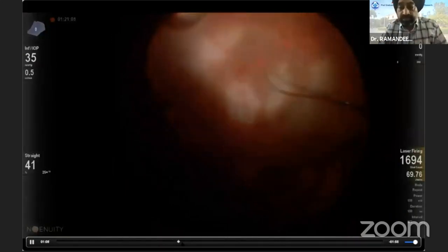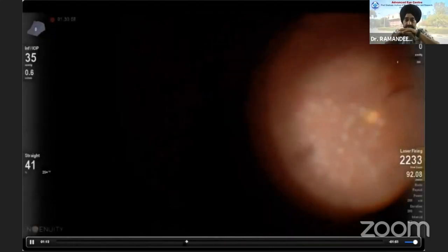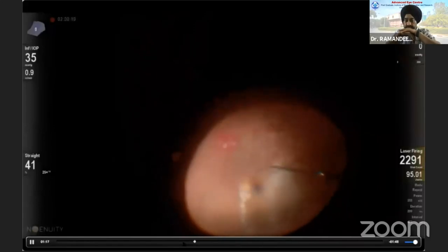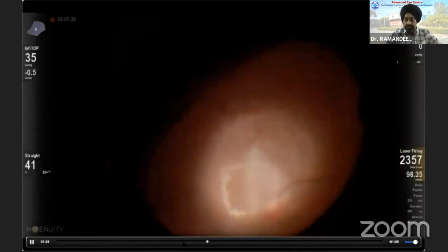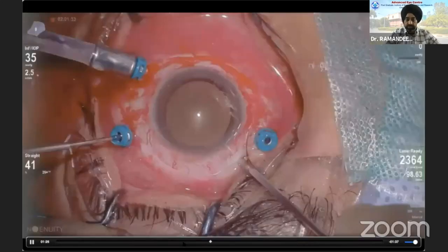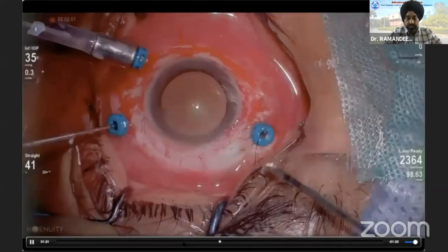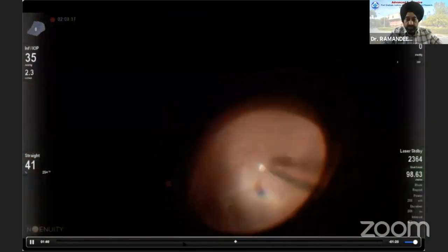So we thought it better to take a biopsy in this patient because the patient is locally immunocompromised, since Ozurdex was given. This is how the site of 2 by 2 mm is prepared. Normal retina and the abnormal retinal part is taken. You can do diathermy also. I prefer laser. You want a 4th port, large 20G, because you want to insert a 20G vertical scissor to carry out this dissection, which is done inside the plane of the laser.